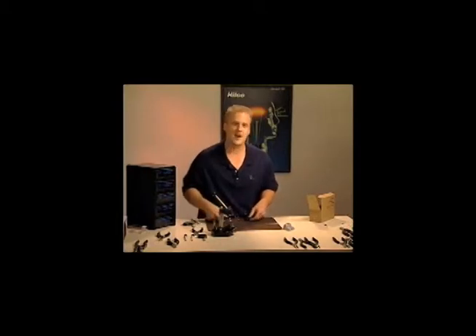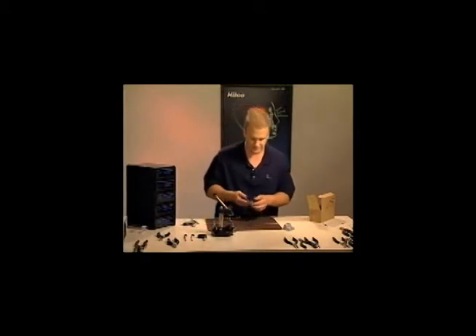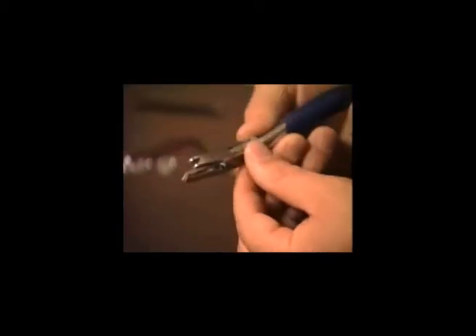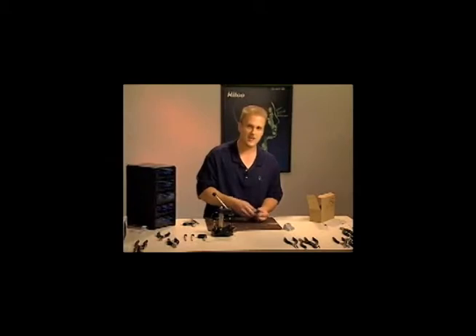But there are pliers out in the market that work much better than a staking tool because they get into much tighter areas. One of those tools is called a zapper plier, and this is designed with a shorter pin than a staking tool. It has a jaw down below to receive the screw that we're punching out. We're going to punch out the screw from the bottom, and it will work in every application in the hinges and most of the eye wires as well.